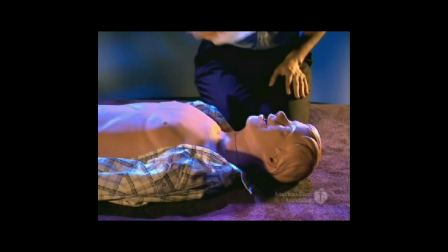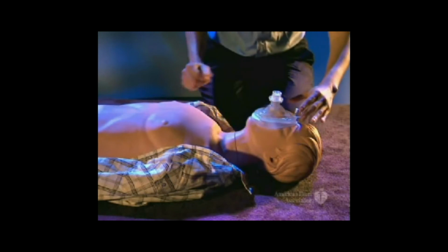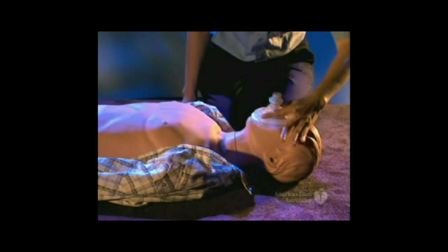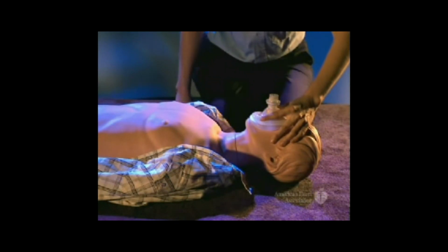Kneeling next to the victim, place the mask on the victim's face, using the bridge of the nose as a guide for correct position. Seal the mask by placing the index finger and thumb of your hand closest to the top of the victim's head along the border of the mask.